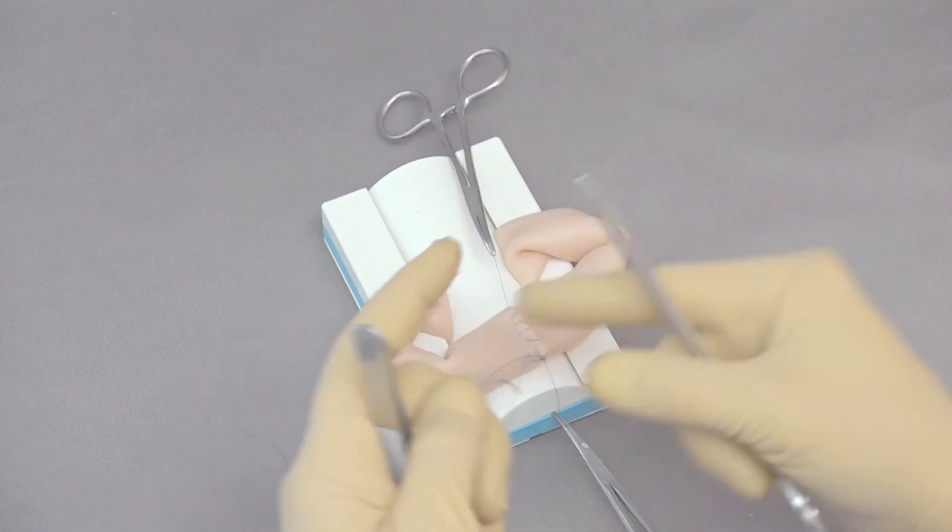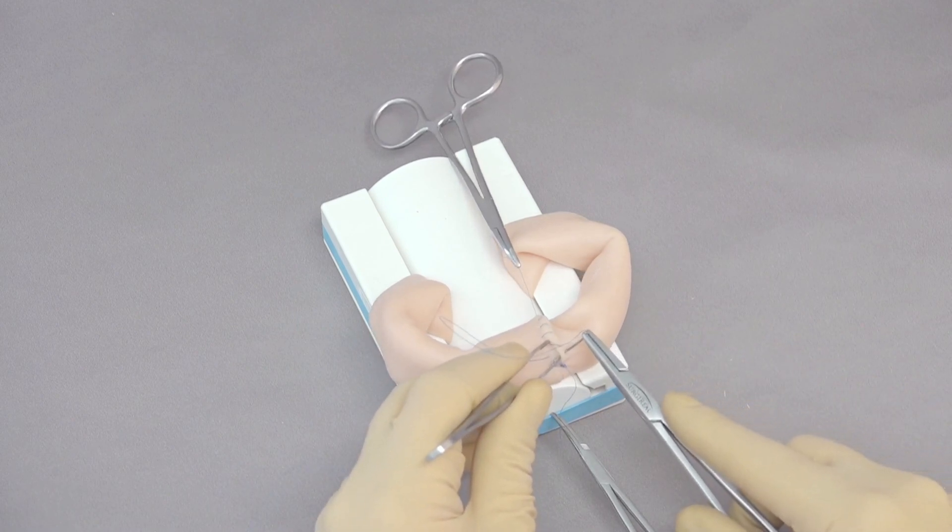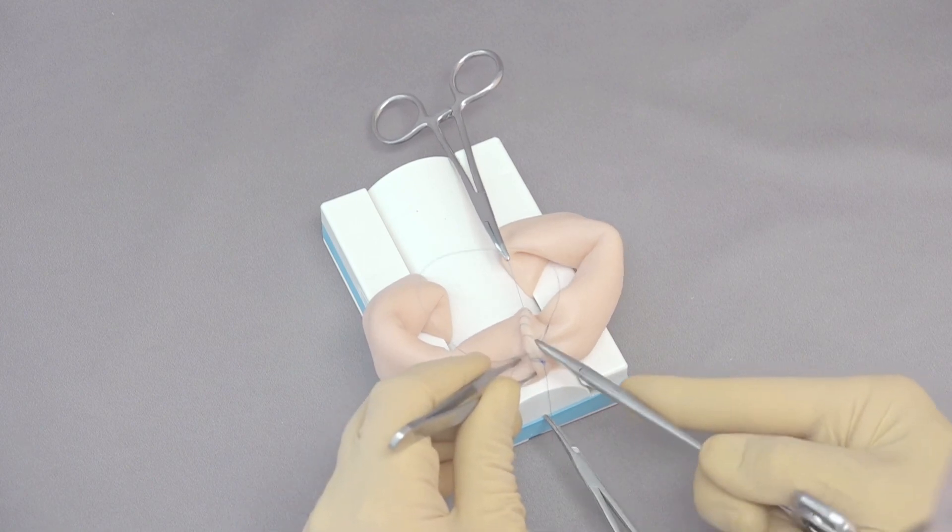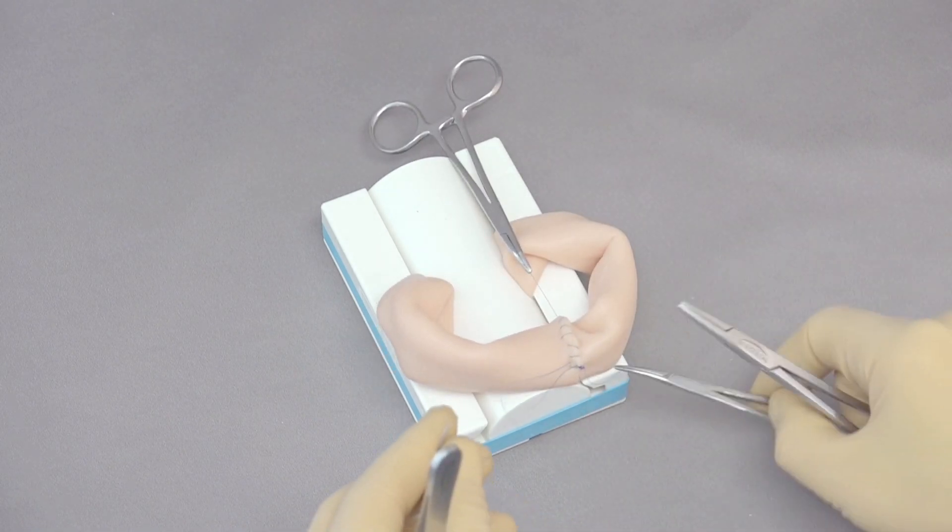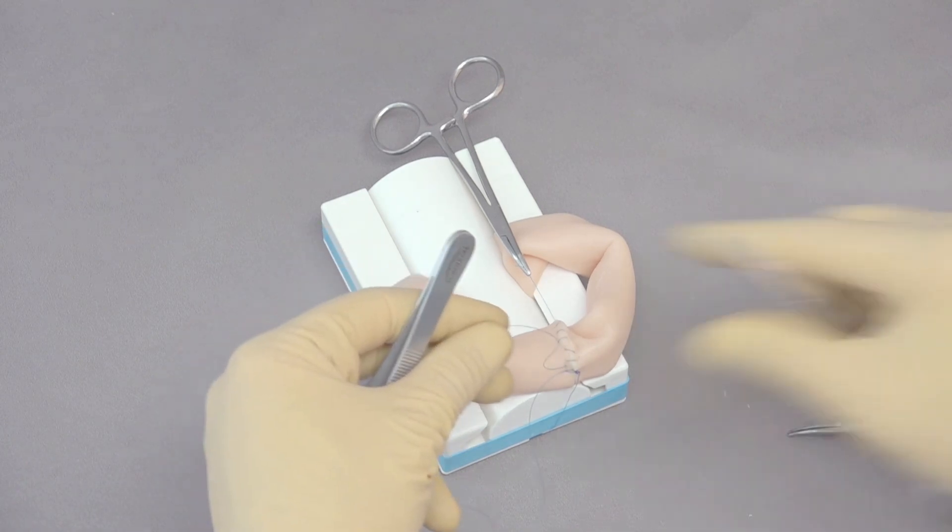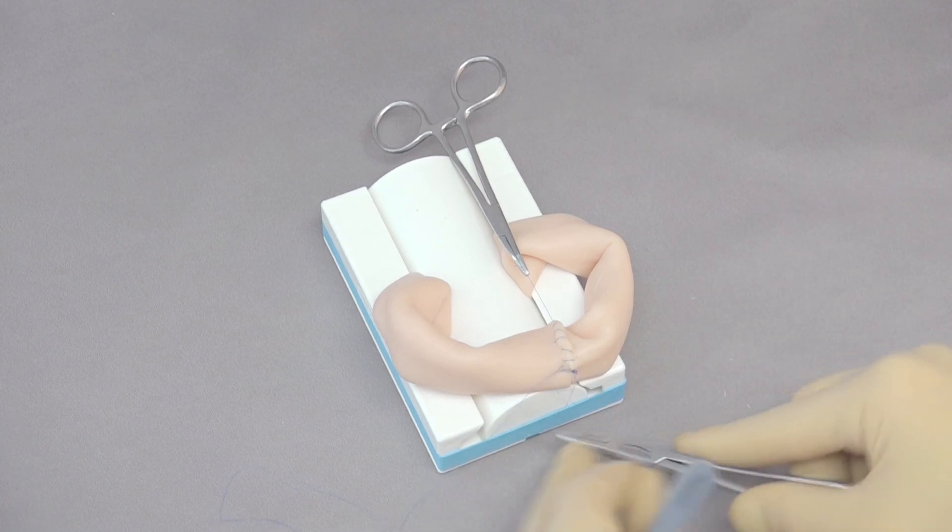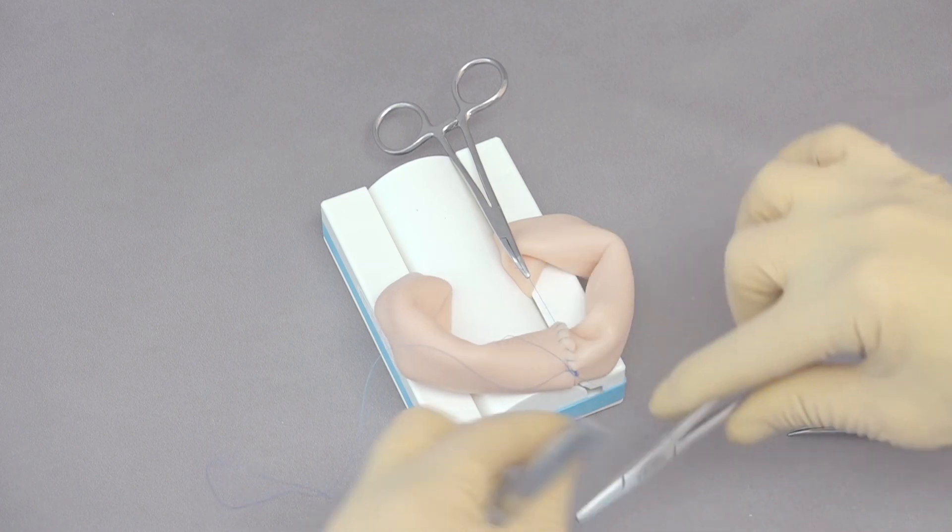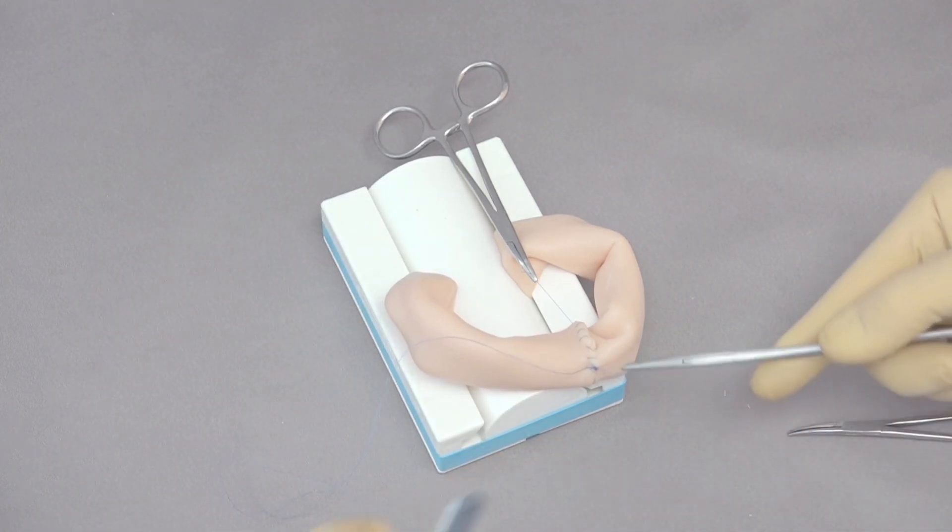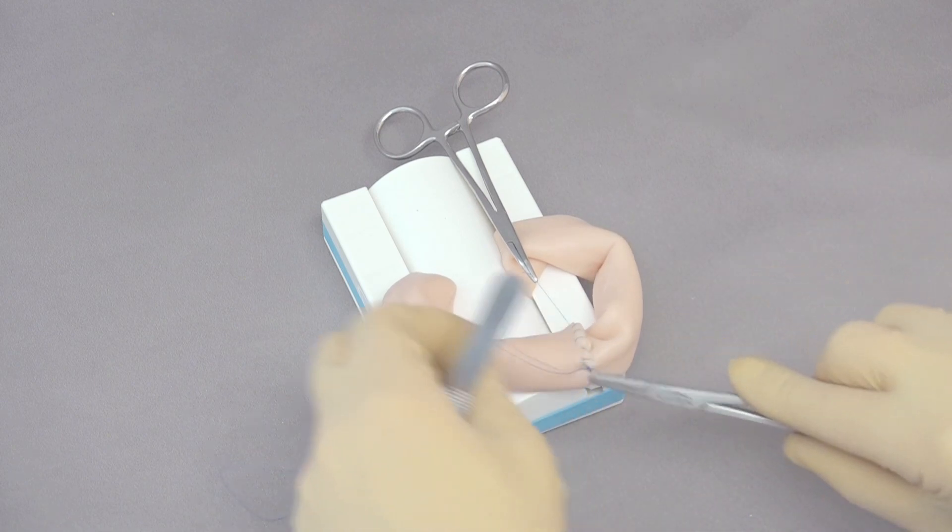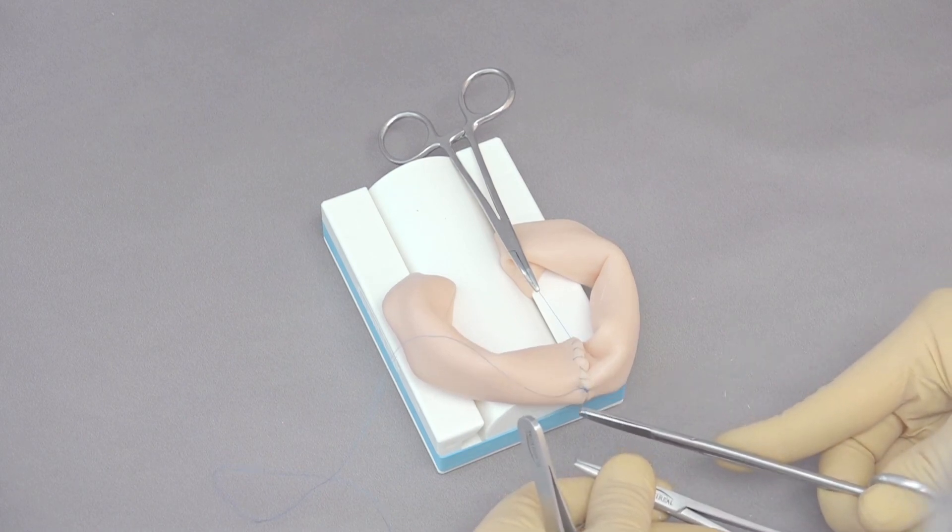And then I'm just going to suture that all the way up to this knot. We've closed this side all but the last little bit and I can stabilize the intestine with my thumb forceps so I don't have to grasp it, go through both sides. Now I can tie this side here over to the short end of the loop of suture that starts on the other side, so I'm minimizing the size of my knots. Make a square knot, tighten, snug down. Fourth throw should be plenty secure with our modern suture material. Because this is going to be left in the abdomen I want to make these fairly short, a couple of millimeters long.